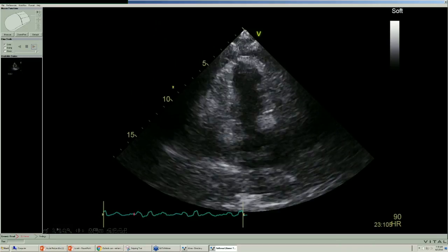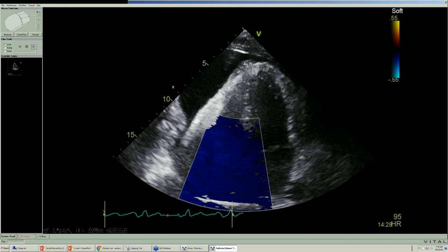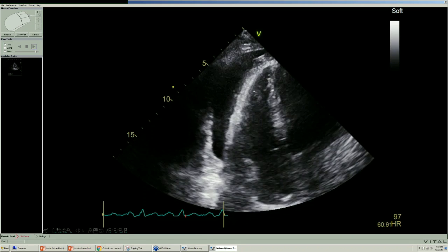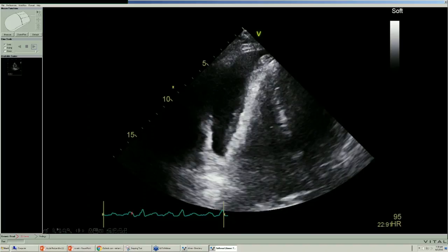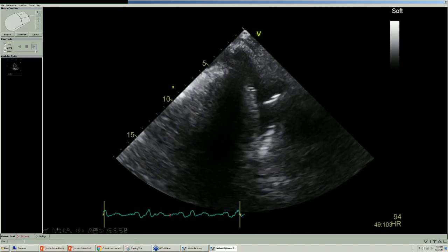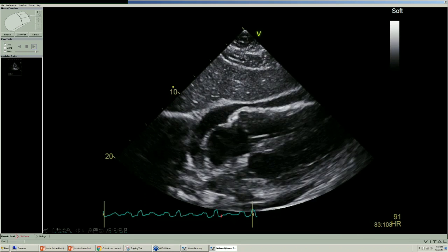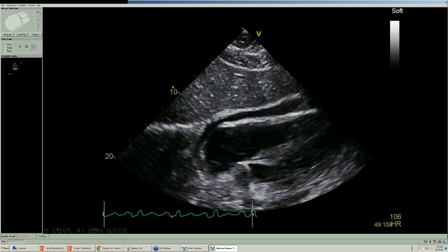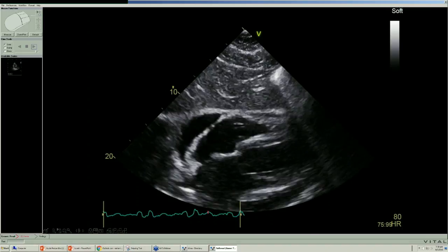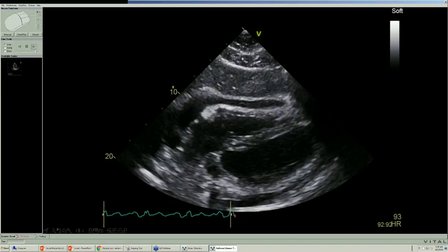And so this is a gentleman who had upper respiratory infection. This is the pericardial space. This is the fluid. This big black space here is the fluid. This is the epicardial surface of the right ventricle. And you can see all the fluid that's surrounding the heart all the way around, both sides. Anteriorly, this patient's on his back. That's a subxiphoid view. Again, you can see pericardial space is filled with fluid, and we can measure that in terms of centimeters. Let me show you the CT.